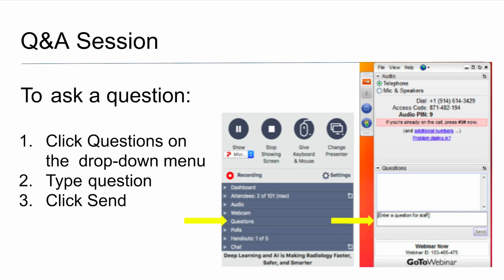Okay, third question. I'm a little unclear how you were able to collect all of this data or simulate low-dose PET accurately. Could you elaborate on this? Yeah, I think there has already been industry or academic standard. We also refer to several other papers already published. Because PET has some unique way it is collected, and all this data is stored in the list mode data. And if we are able to read the list mode data, it's basically a collection of all the events collected by the sensors.